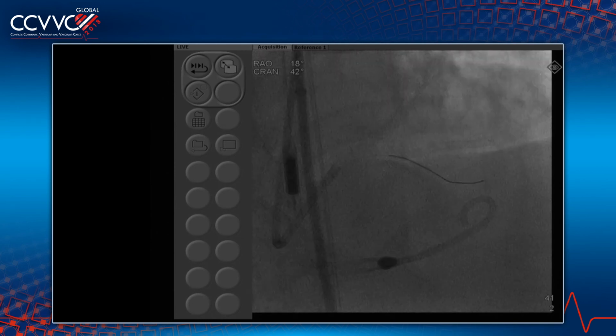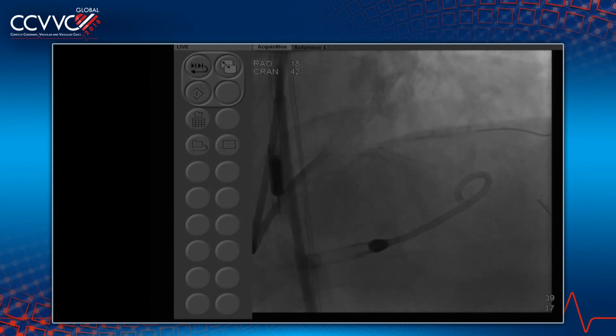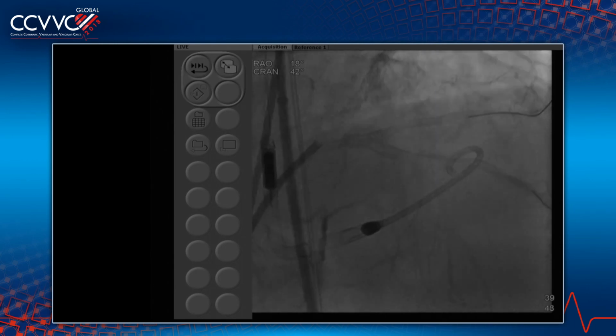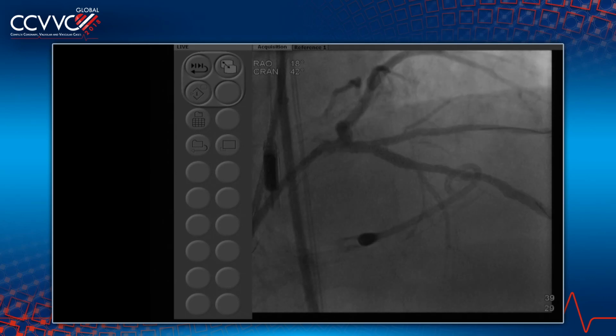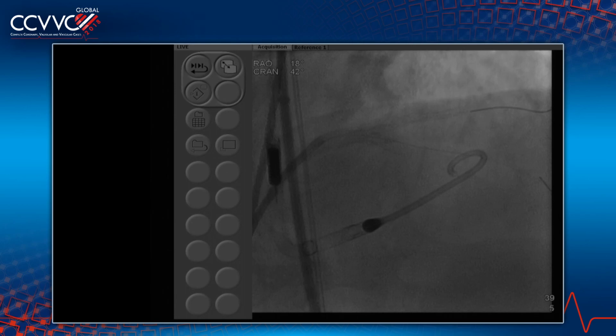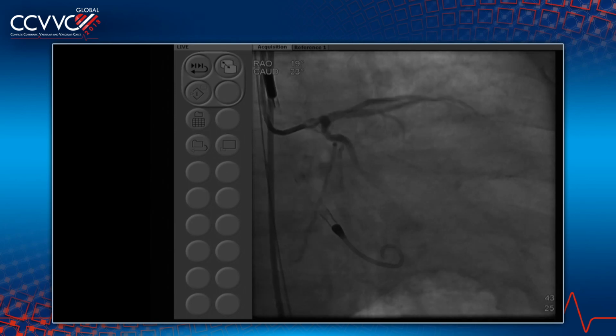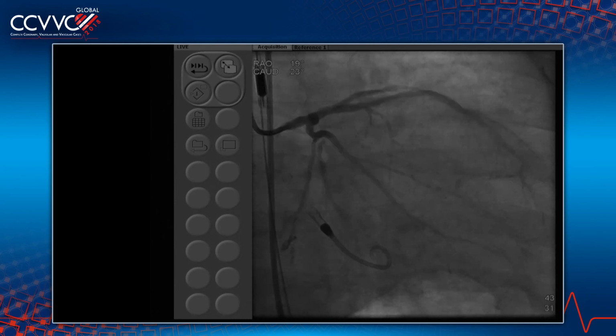So you can leave the left main, it is fine. But before, the LAD was severely diseased by FFR. And this is the final picture of the mini crush. You abutted the stent into that diagonal, right? Yes. So there's no space there. So it really is a long two stents in the diagonal with a mini crush into the LAD. This is the final picture. Look at the circ, looks good. LAD diagonal. So essentially three stents, and our total dye use was 170.